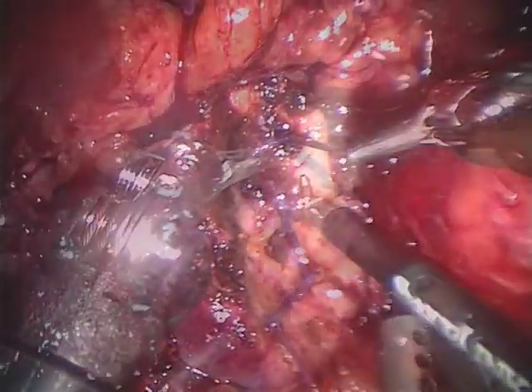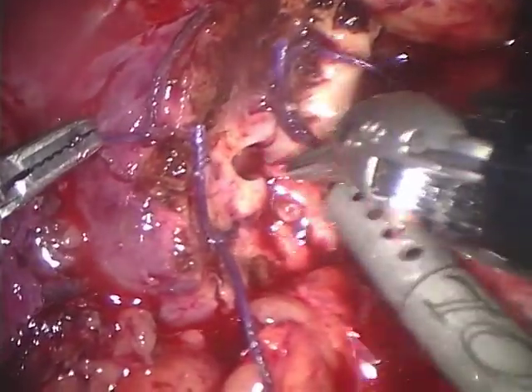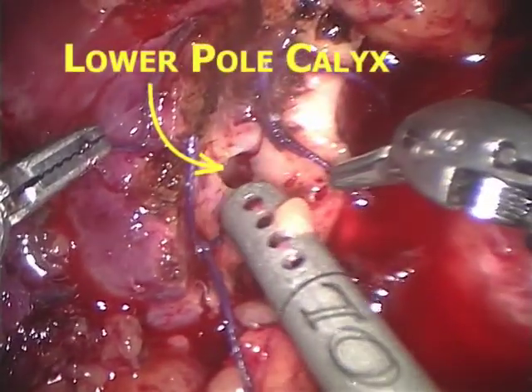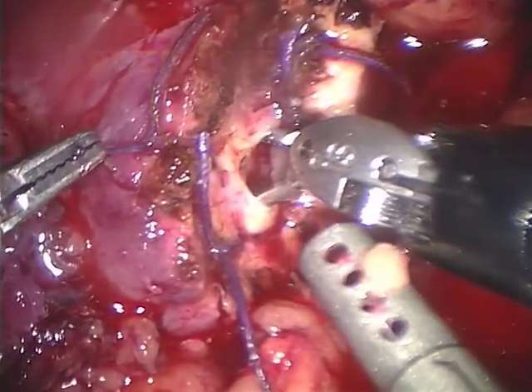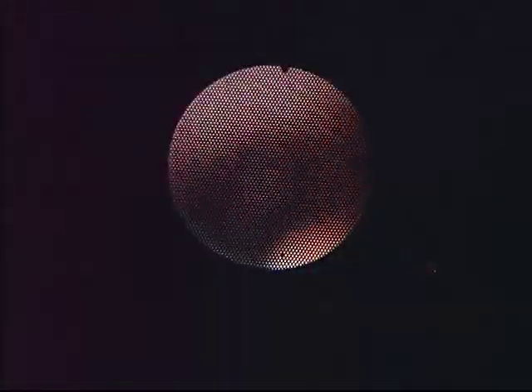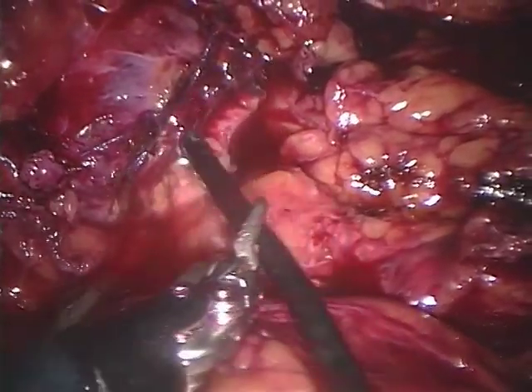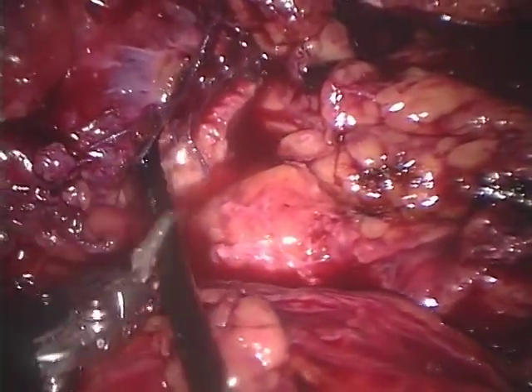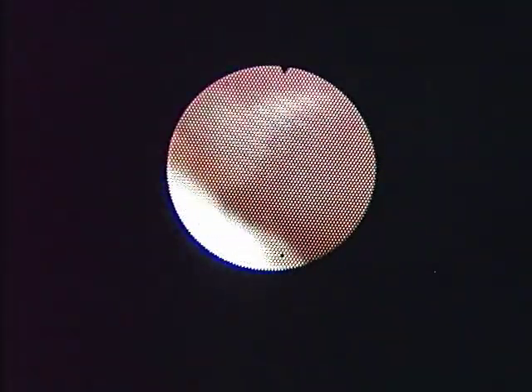At this point, the arterial clamp has been removed and excellent hemostasis is confirmed. Here you see a well-preserved wide opening to the lower pole calyx. Prior to performing the anastomosis, a ureteroscope is placed through the trocar into the operative field. It is directed into the lower pole calyx and the entire kidney is inspected. There were no stones identified within the kidney.